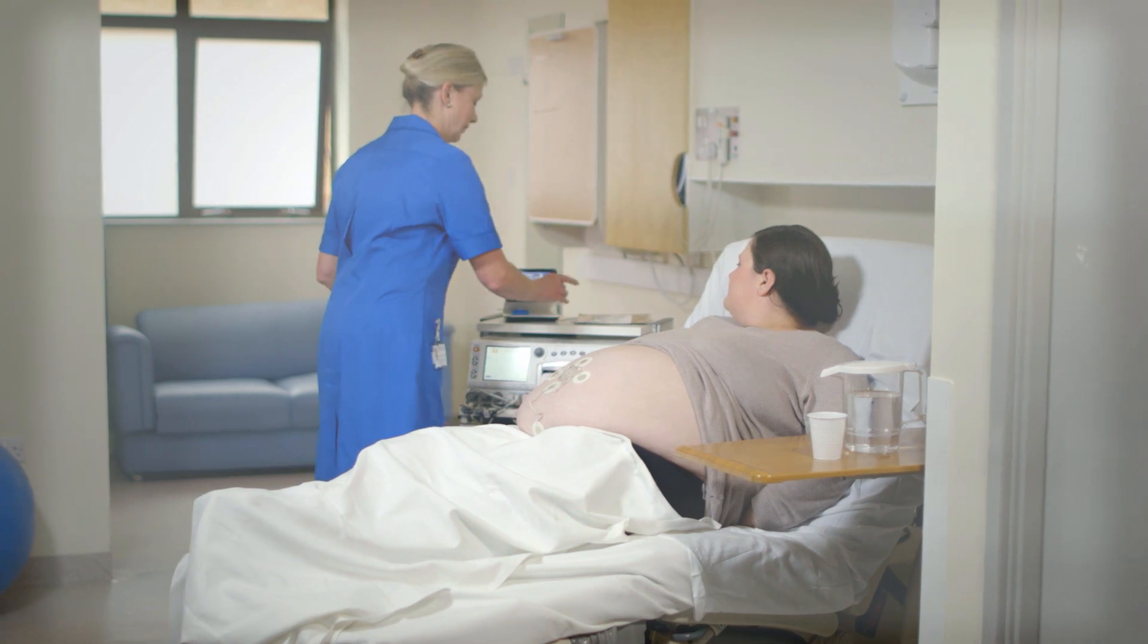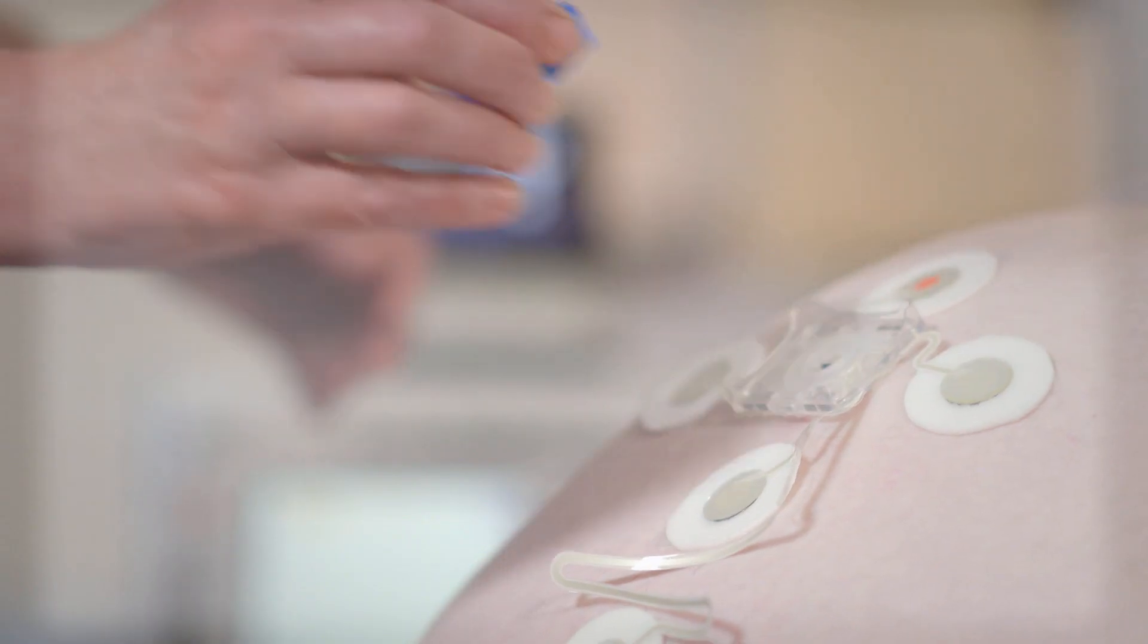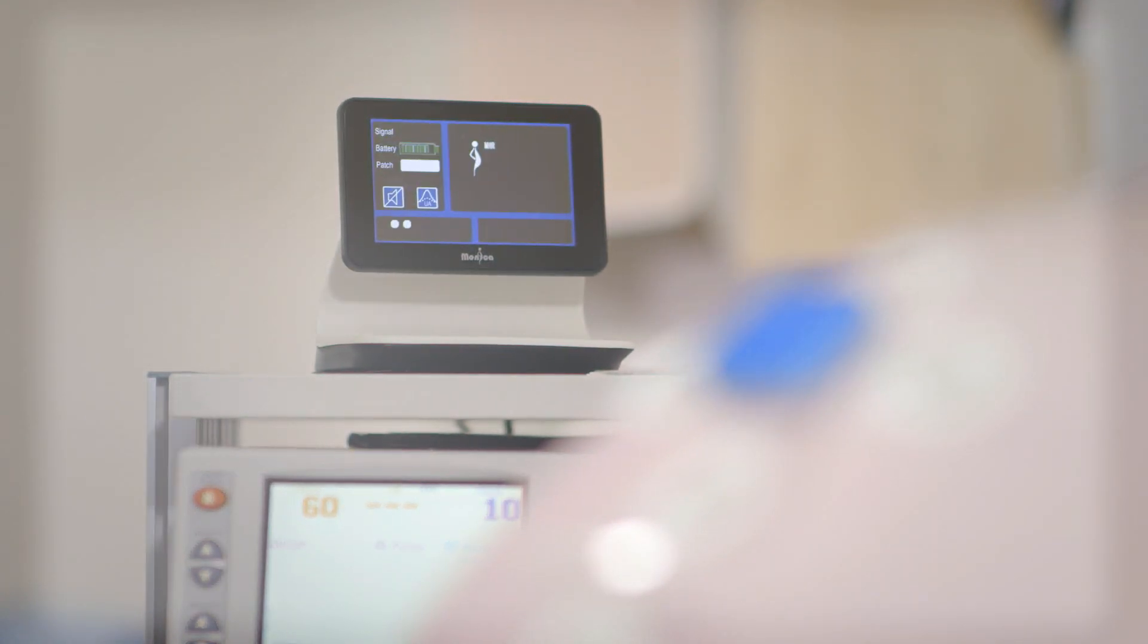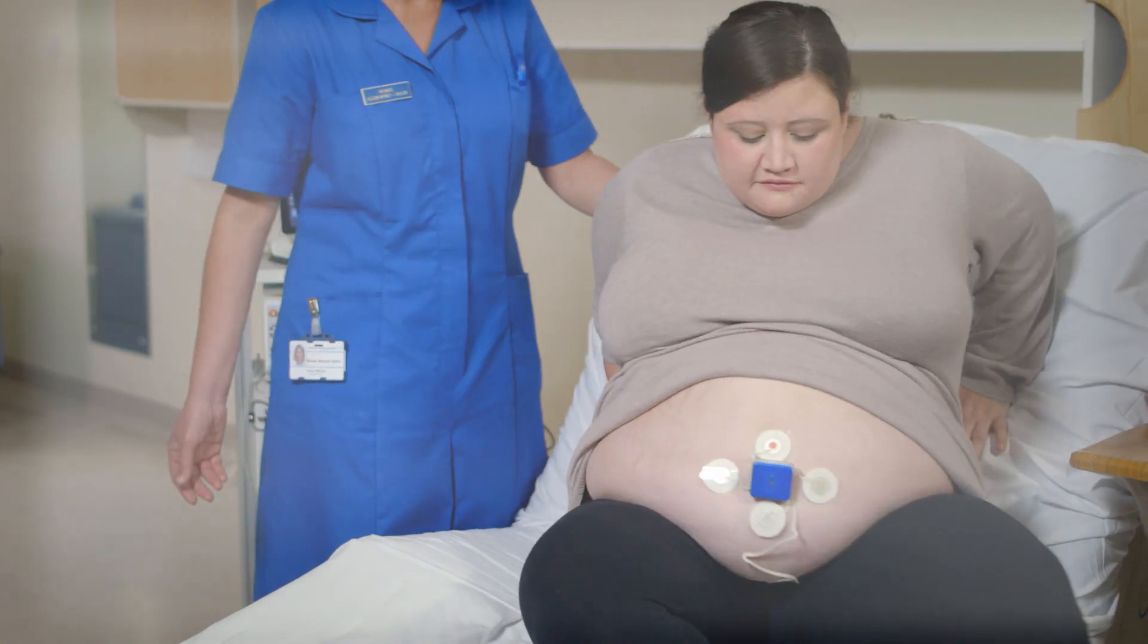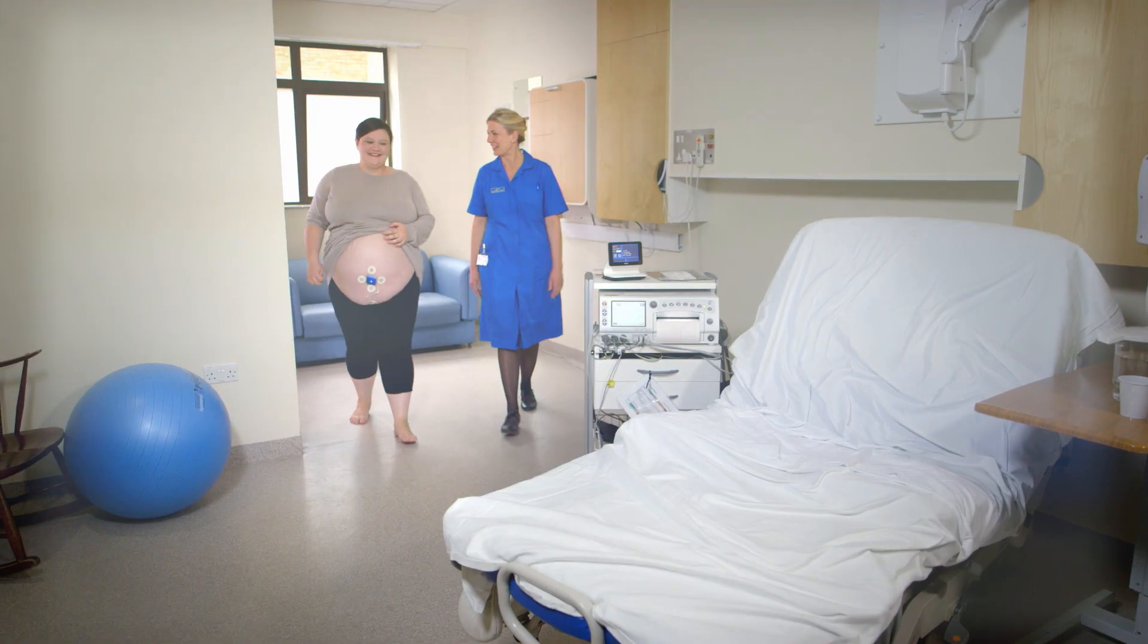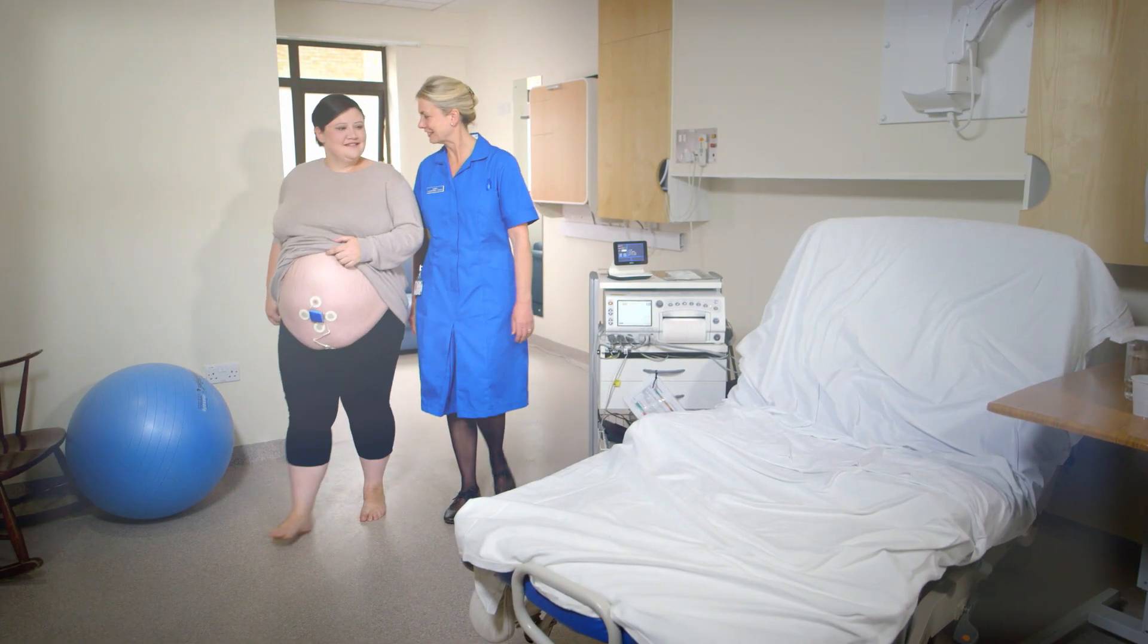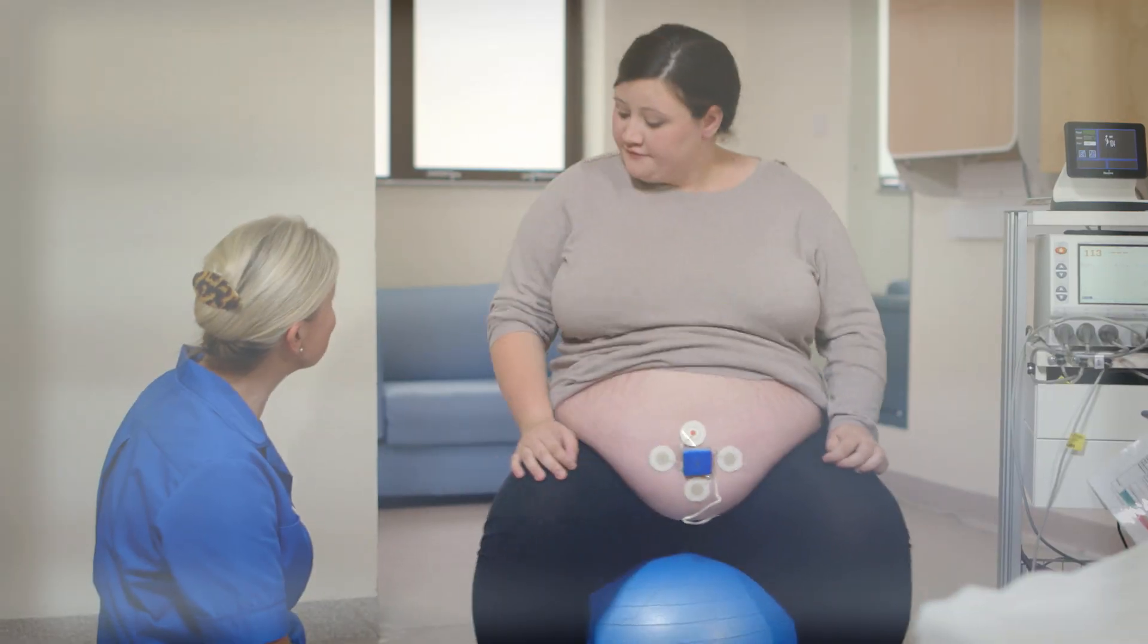Having recognized the challenges of monitoring high BMI patients, increasing patient satisfaction, and driving improved clinical workflow, Novi offers a new, easy-to-use solution that is accurate, comfortable, and can allow the patient to ambulate freely within the room.